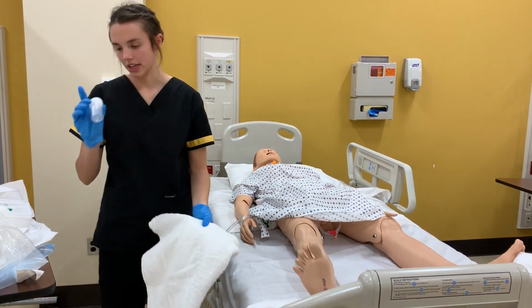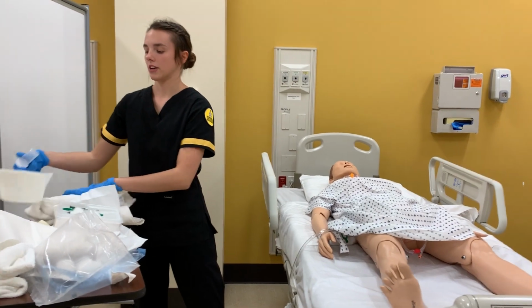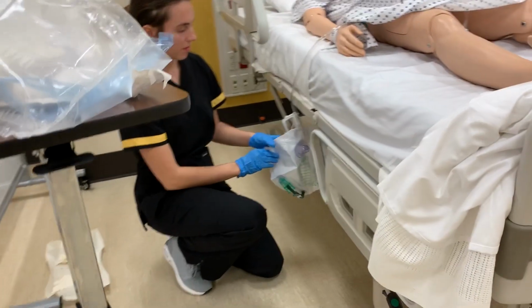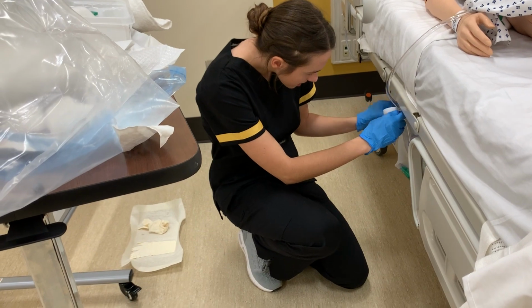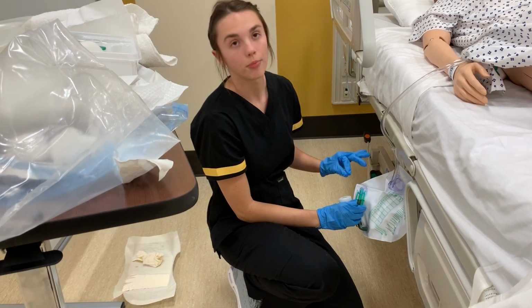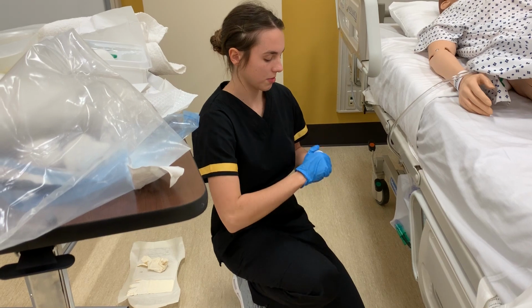And we can just do it with the cup that comes in the kit. And if not, we would be using one of these to precisely measure after it had been in for a while. So when we have the bag down here hanging, it will stay hooked in there. We collect from this little port right here, and as I begin my collection, I would have alcohol prep pads that I would open. Let me go ahead and open my cup.